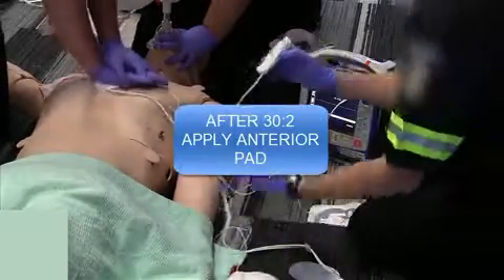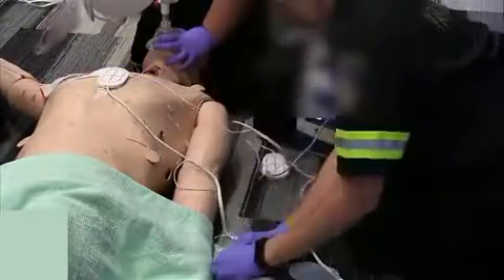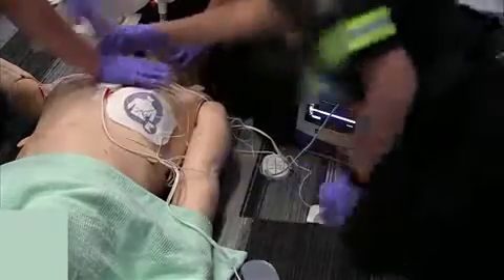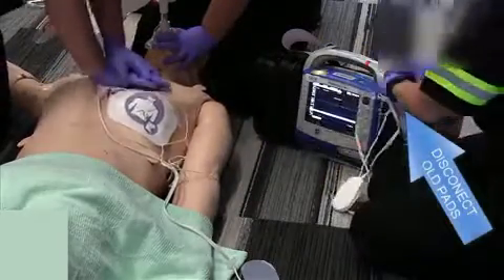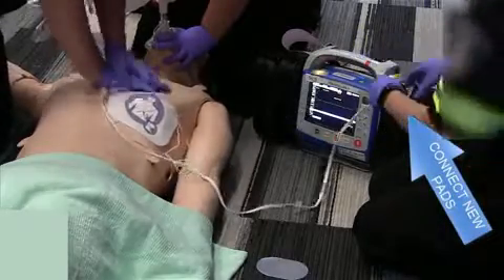25, 26, 27, 28, 29, 30. Okay, I'm disconnecting the old pads. Connecting the new pads.